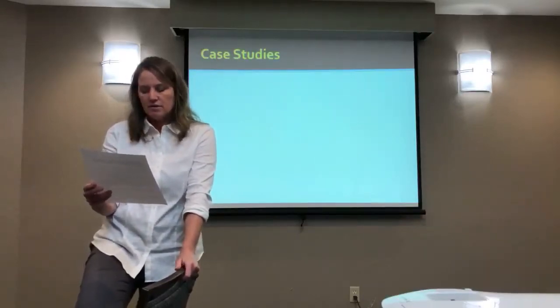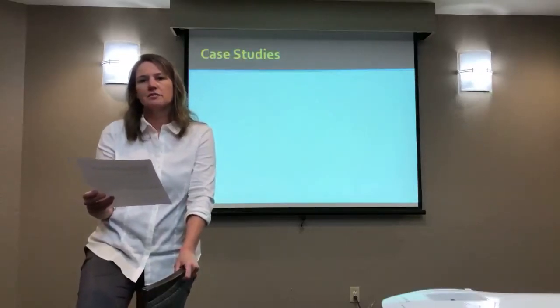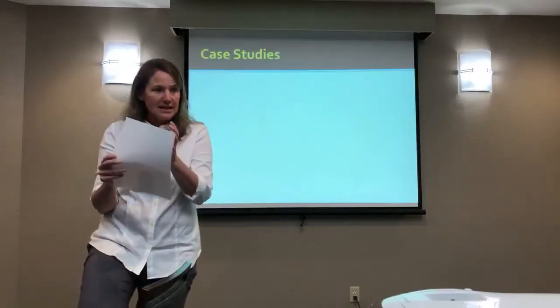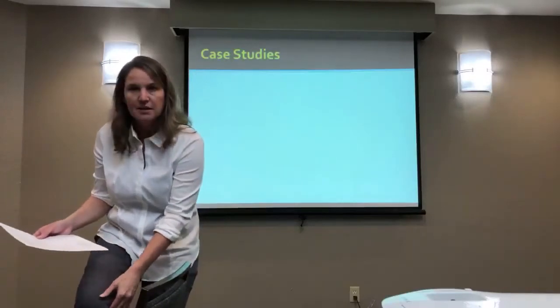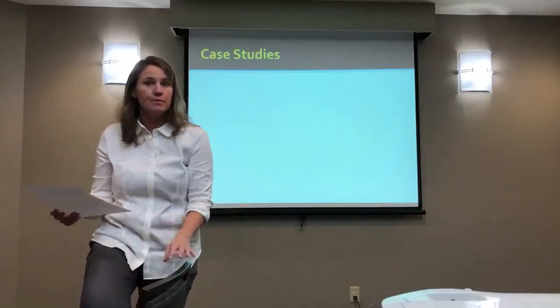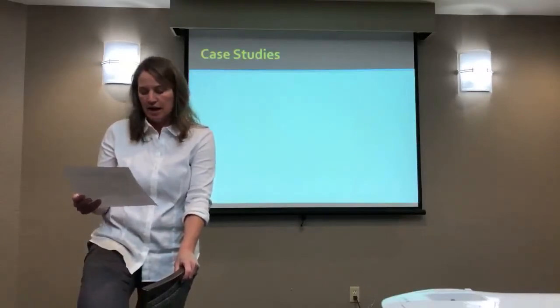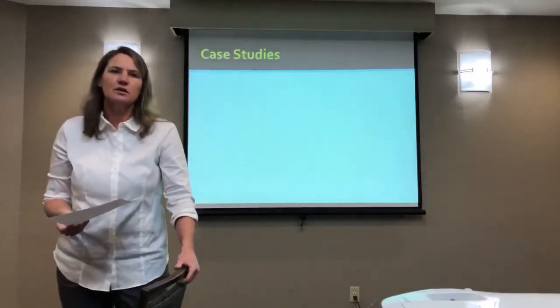Now, the location of it, what would you think for your... I think it depends on the size of the person. It does depend on the size of the person, so whether they're really teeny tiny or fairly large. So a teeny tiny person, the ligament can be fairly superficial, so 3 megahertz could work.